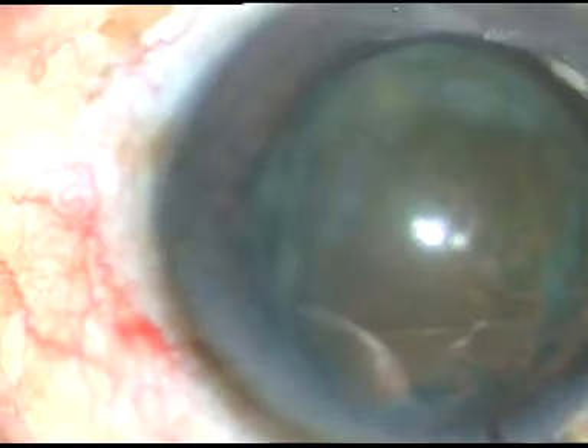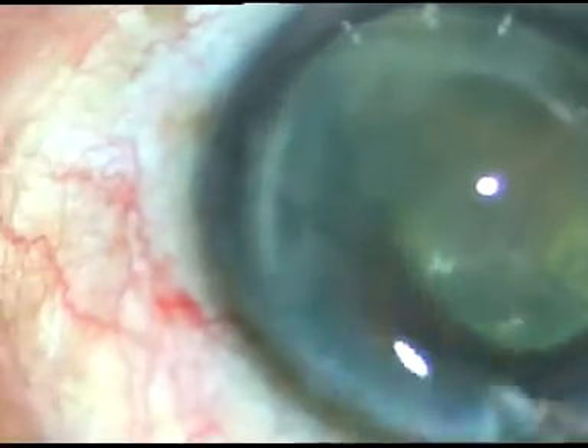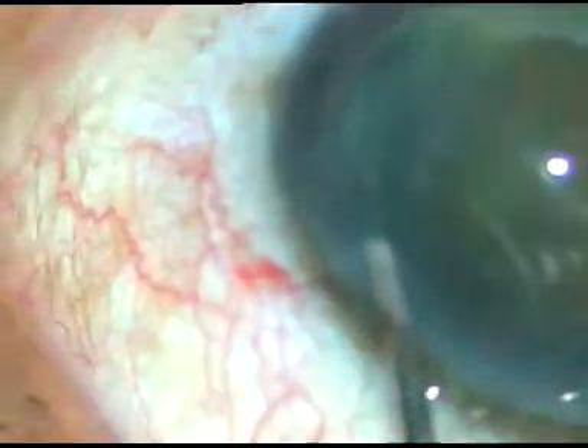I inject viscoelastic substance on either side of the nucleus. Some viscoelastic substance is being sprayed over the corneal epithelium for better visibility, and some more visco on the other side of the nucleus.